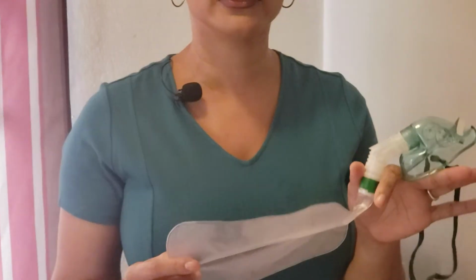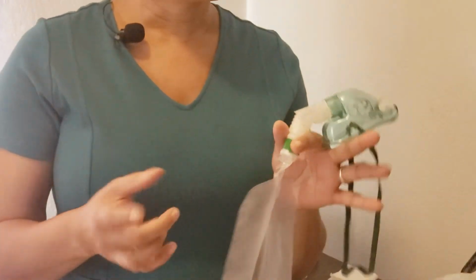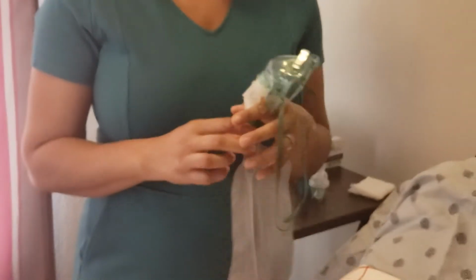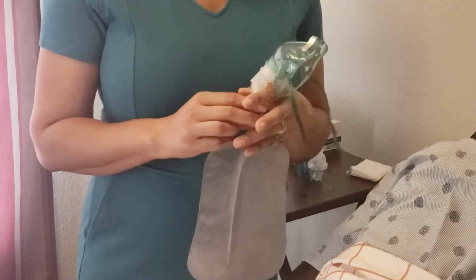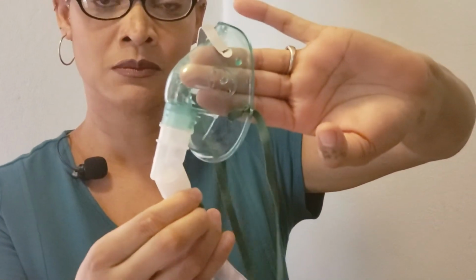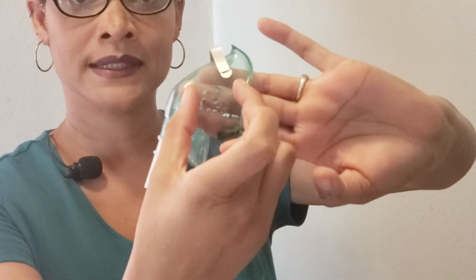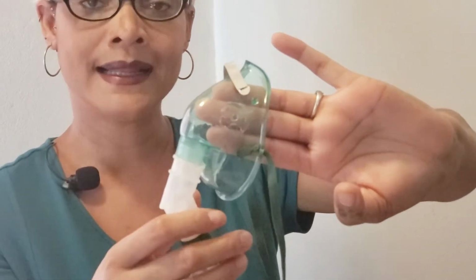Next, we will talk about the non-rebreather mask. This is a high concentration mask that delivers what we consider 100% oxygen. However, it's more like up to 80%, because the only way to really deliver 100% oxygen is with an ET tube. So you will notice that the mask on this is just a little bit different. This mask has smaller holes. There's usually a circular tab that goes over this, and that stops the air from going in.